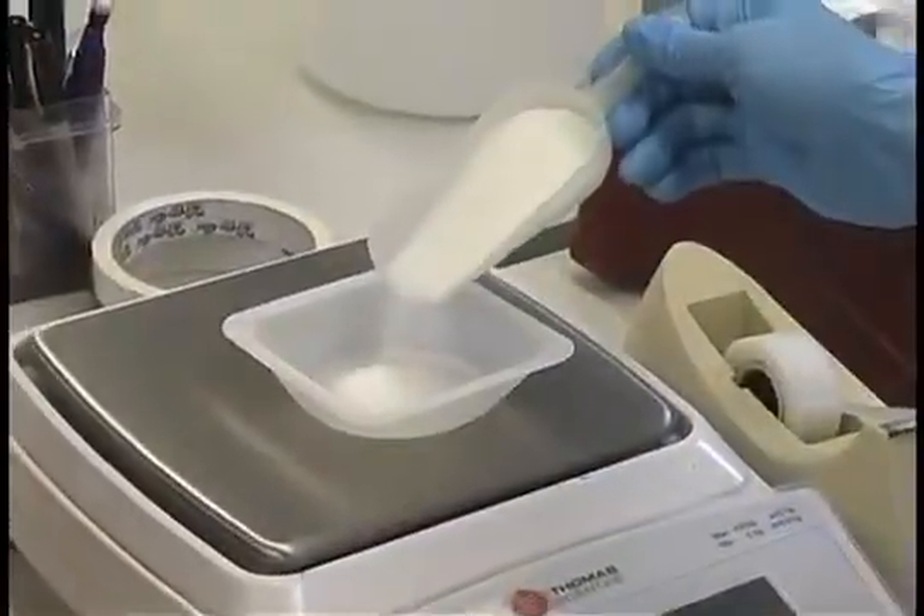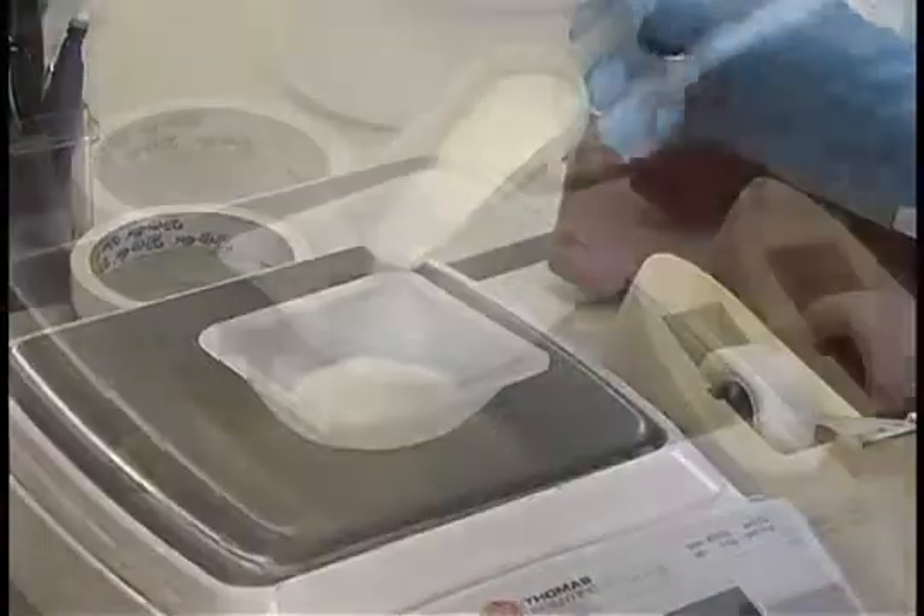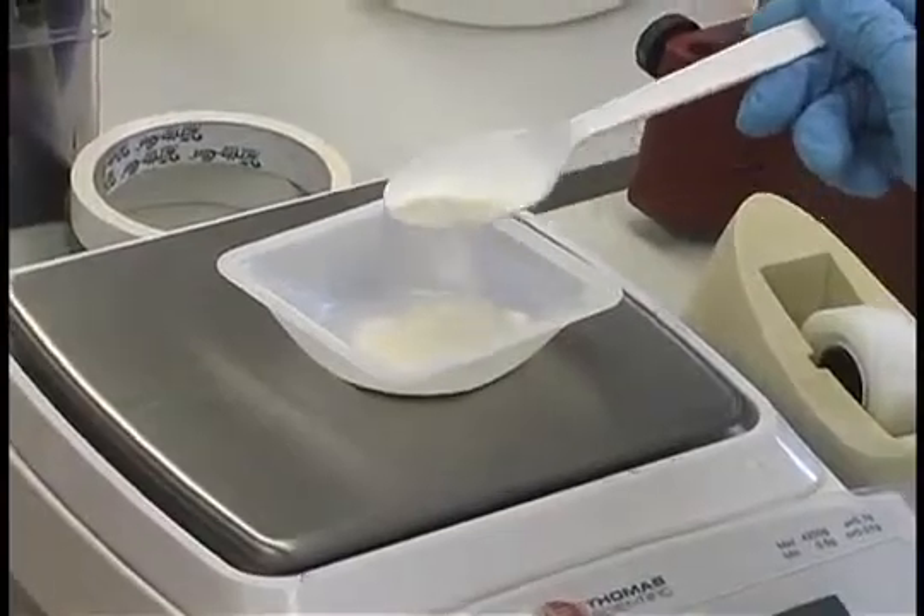Repeat the procedure with all other dry chemical items that are going to be included in the medium. This includes carbohydrates, gelling agents, or other components.